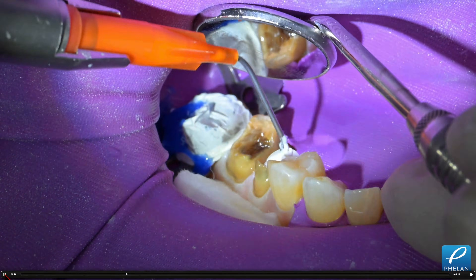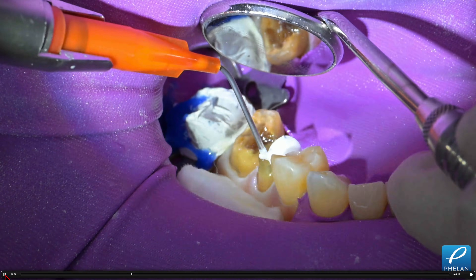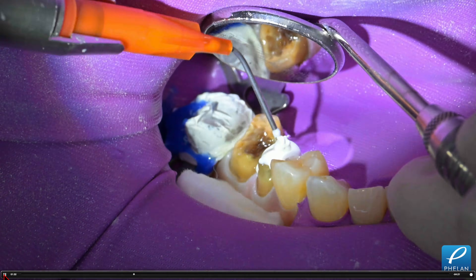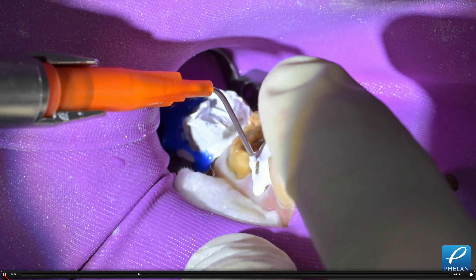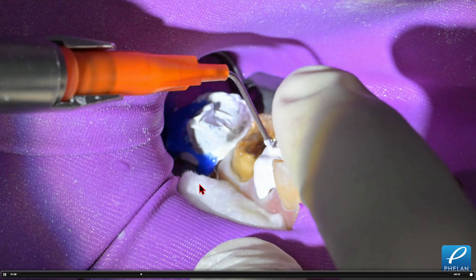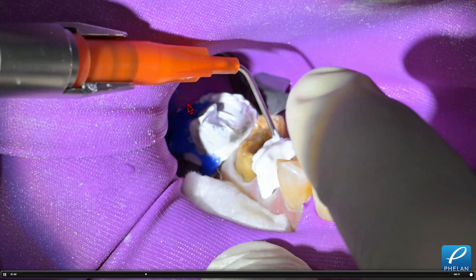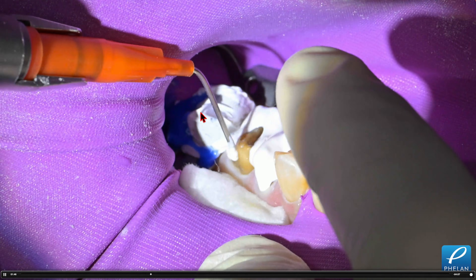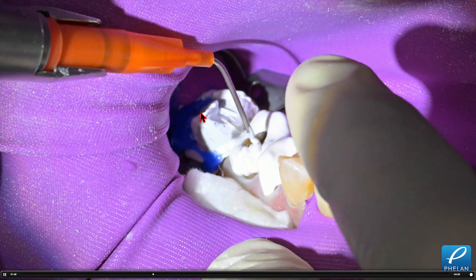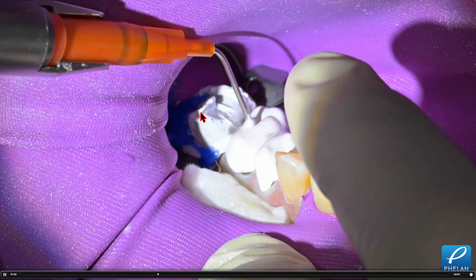I do a lot of my core buildups in posterior preps with a rubber dam. I've cut a slot in the rubber dam to do the buildups and put a cotton roll in. This isn't acid etch — this is Ultradent blockout resin. I've covered the second molar because we're not treating it; it's not in occlusion, so we took it out of the treatment plan.